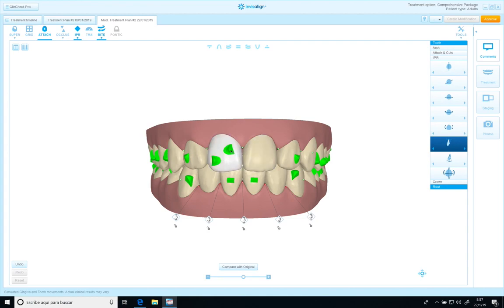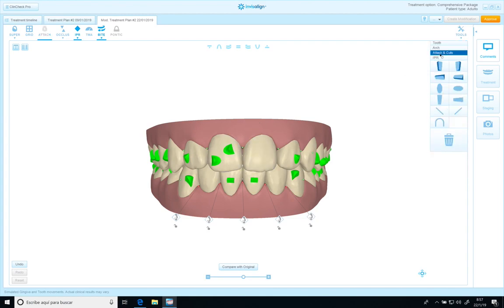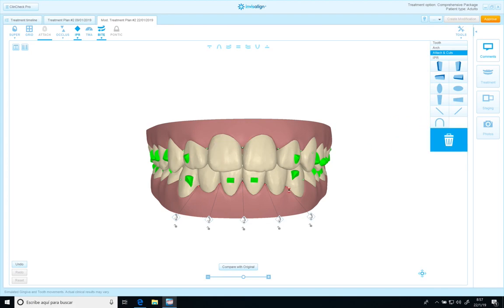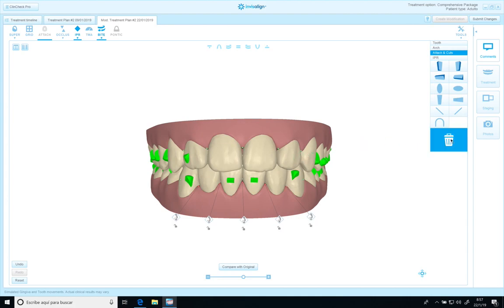I don't want to use this double attachment because I know that if I plan an intrusion movement, just using the initial edge is enough to change the tip. So I'm going to take this out, also this out, and also this one.